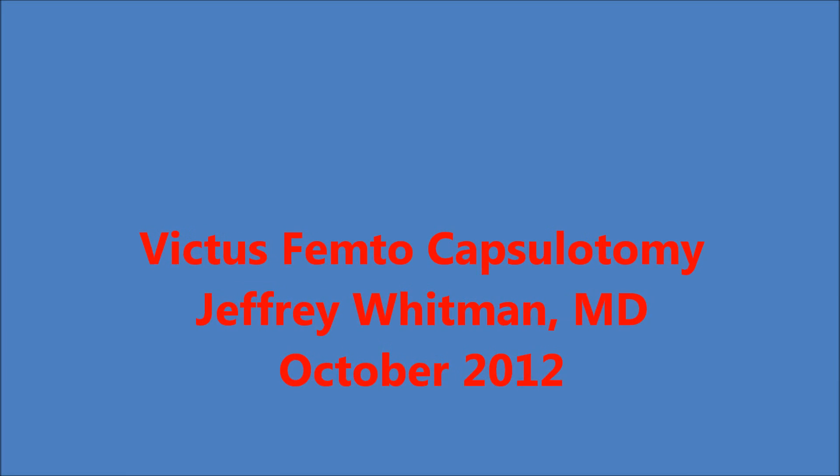This is Dr. Jeffrey Whitman demonstrating the Victus Femto 2nd Laser Capsulotomy.